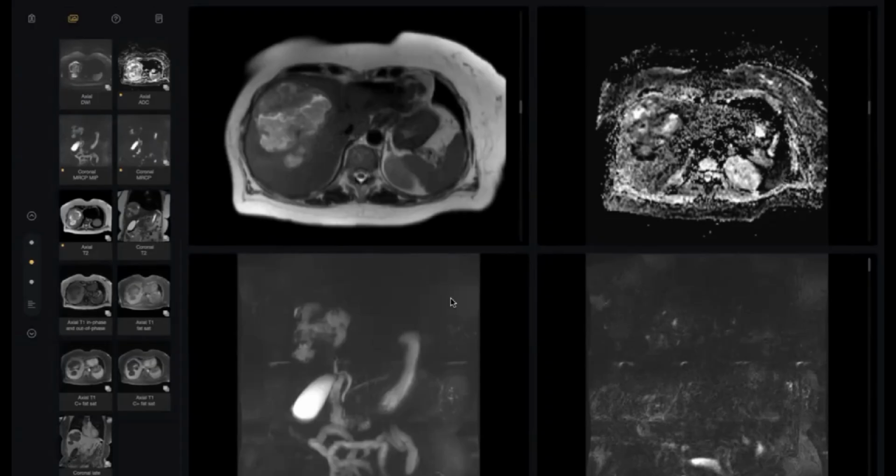What else? What is the management here, according to this size? It is large in size, so maybe there is a role for intervention, and maybe a role for surgical drainage. Okay, doctor. Thank you so much, my colleagues.